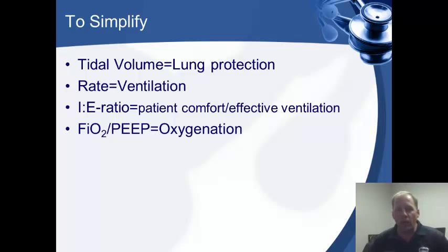Now your IE ratio, this is a new setting for this ventilator compared to the ones we've had before. So this ratio is really important to set, especially when you're talking about obstructed patients, because those patients need a little bit more time to exhale. So you're going to want to increase the IE ratio to 1:4 or 1:5 and give them plenty of time to do that, as well as lower that rate so that they have plenty of time to exhale before they get that next breath.